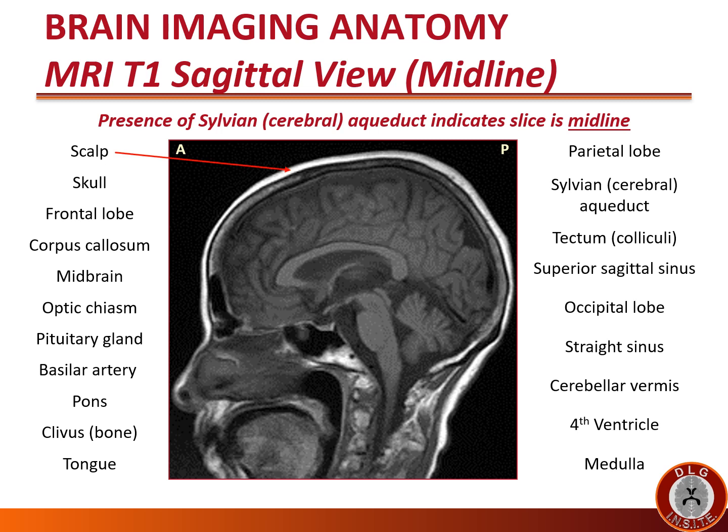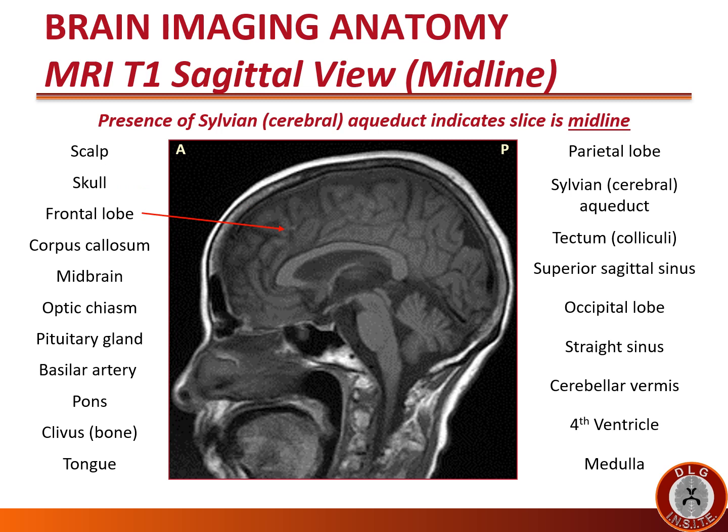Fat is hyperintense or white on a T1 image, so the outermost white band in this image is the scalp. The next layer is the skull, which has three distinct layers: the outer layer is black or hypointense, composed of calcified compact bone; the middle white layer is composed of fatty marrow in spongy bone; and the innermost layer is also black, again composed of calcified compact bone. The front part of the brain is the frontal lobe.